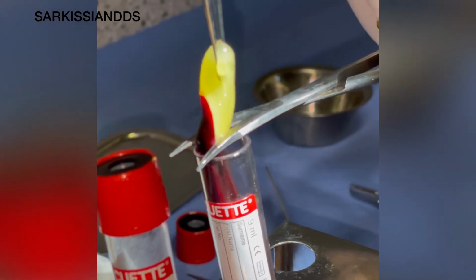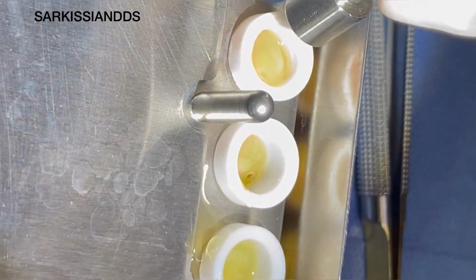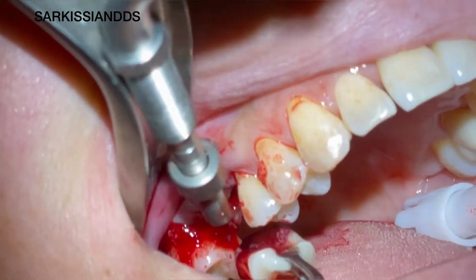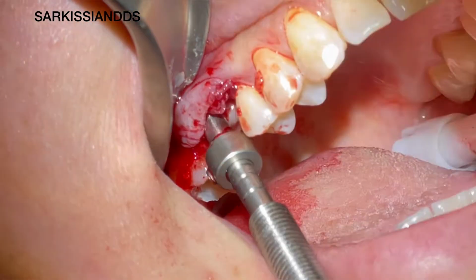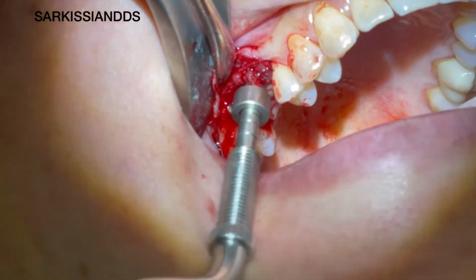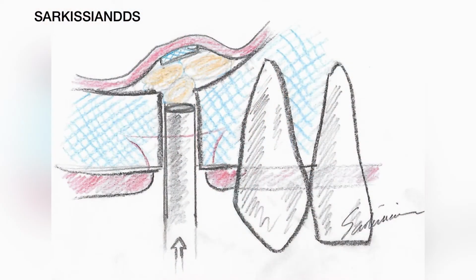Now, earlier on, we had drawn a few vials of blood from the patient to be able to harvest some PRF, which we will be using for the sinus lift. After irrigating with ozonated saline, the PRF plugs are introduced into the socket and gently pushed up. This will allow the sinus membrane to separate from the sinus floor bone and lift up higher. And after inserting 2 to 3 PRF plugs, we are ready to insert the implant.